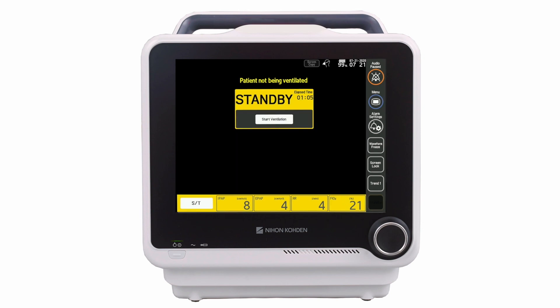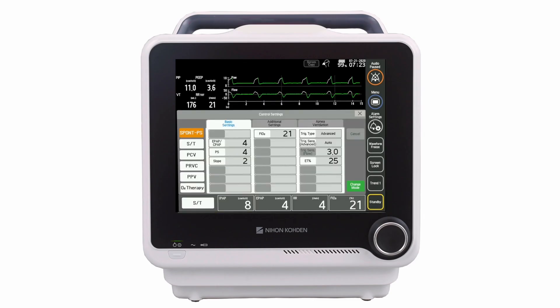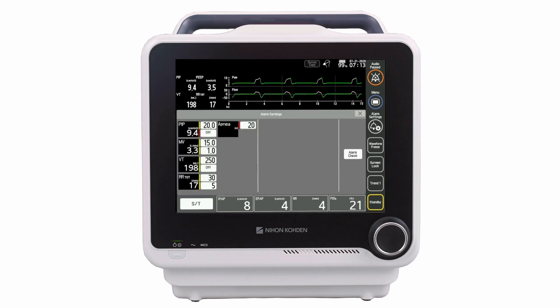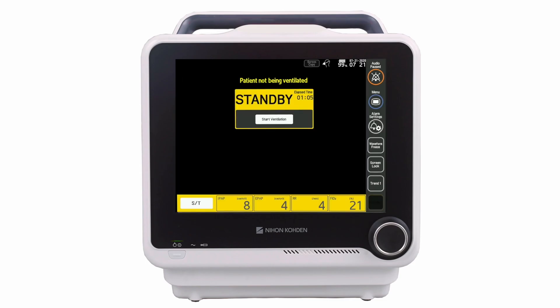Prior to starting ventilation, clinicians can pre-select the mode and ventilation control settings and alarm limits. Press X to go to the standby screen. When ready to begin ventilation, press the Start Ventilation button.